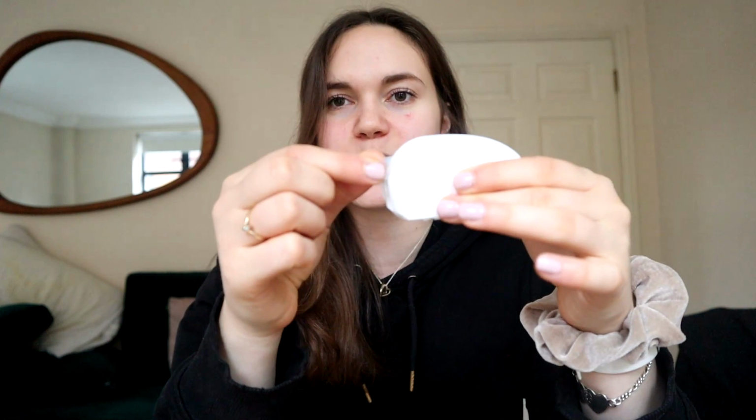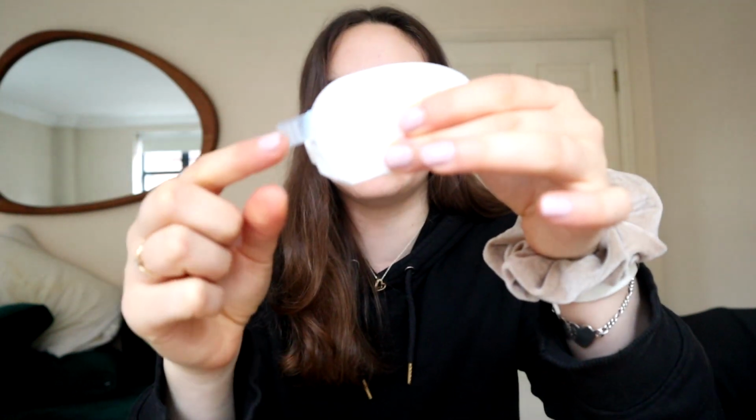Was surprisingly even better than normal, it really didn't hurt. So obviously this is the leftover bit from where the cannula went in. If you can see that little tab, just pull that out, and this is all done with, and we can put this to the side. So that is the cannula in, infusion site ready to go, and obviously that's where the pump will then sit.